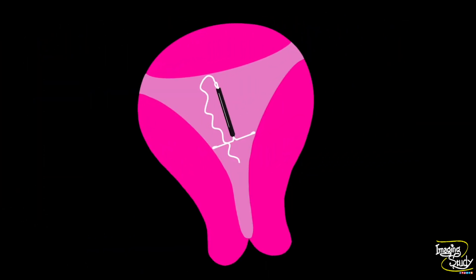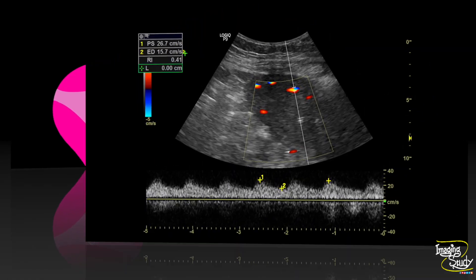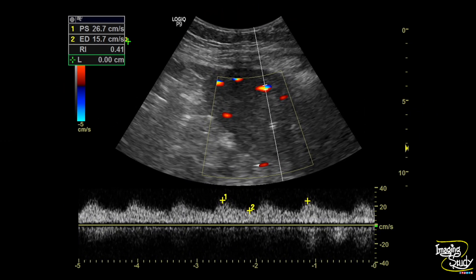I am trying to demonstrate the position of the intrauterine contraceptive device in this diagram. It got malrotated or twisted during insertion, so the appearance came like this. Usually when we see the intrauterine contraceptive device at the level of the body, we note it as a normal device in situ — but we definitely should check the location of the horizontal part.